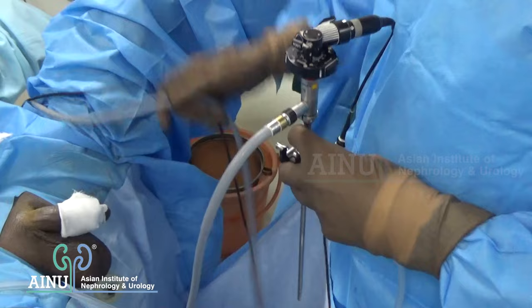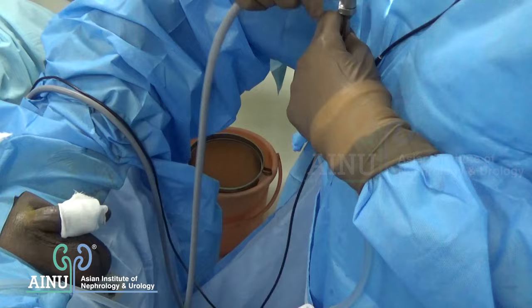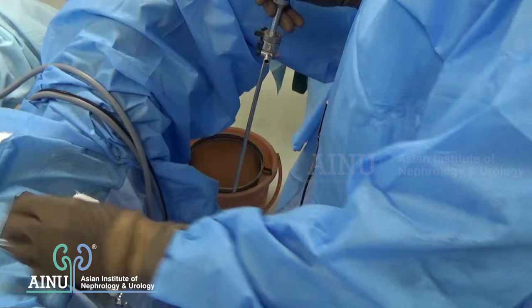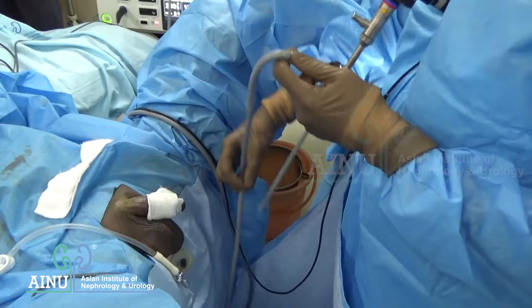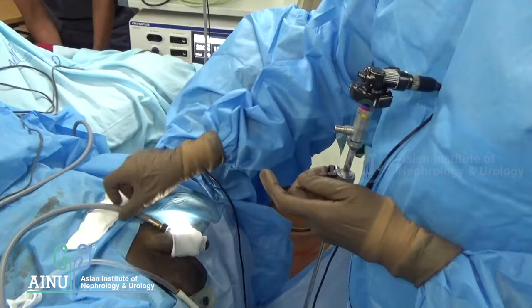An important point is the placing of cords and structures. Majority of the time most of them loop down, causing a lot of weight on your hands. The least mobile structure should come first onto the patient so we don't need to move it repeatedly. The second thing is the highest weight item - the light cord - which should always be placed at the top onto the abdomen of the patient.